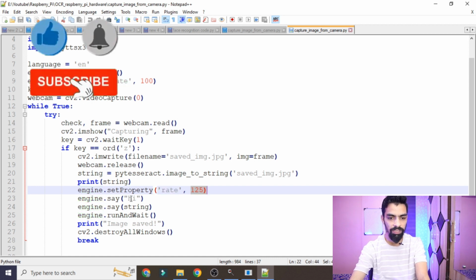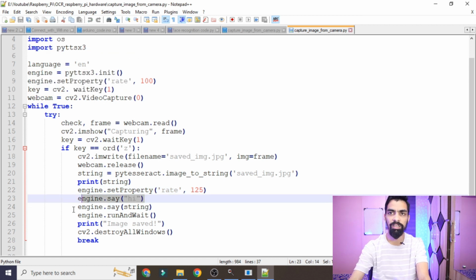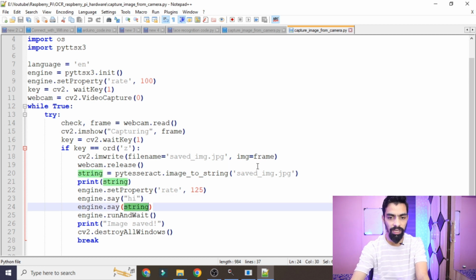Now first, by default you can use "hi" here, so that it starts speaking. Then after that the string, whatever image the Raspberry Pi captured, it starts speaking that word by word. Whatever string we capture, the Raspberry Pi starts the text to speech converter in this line.